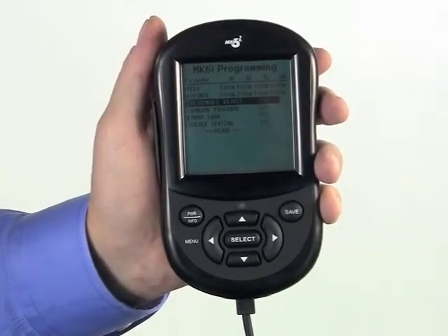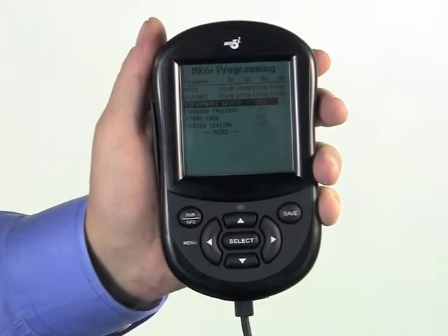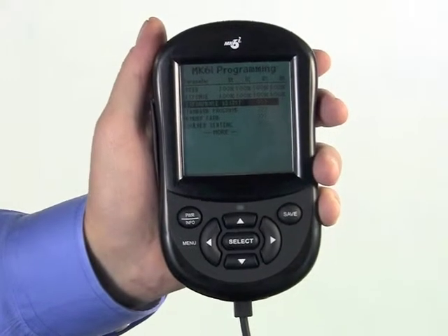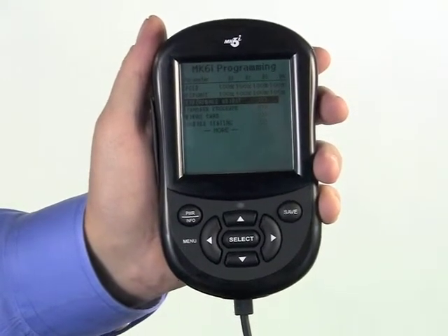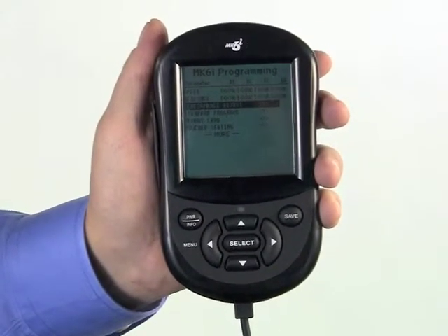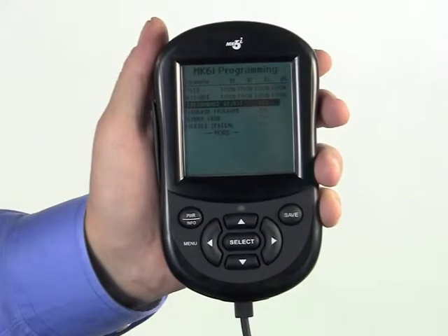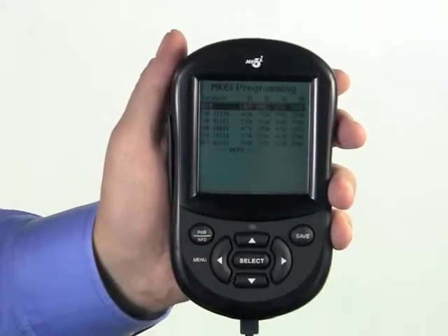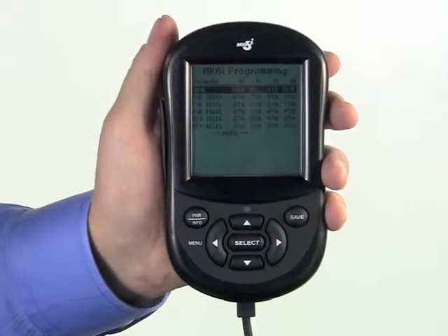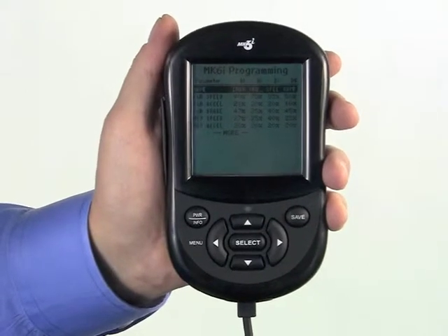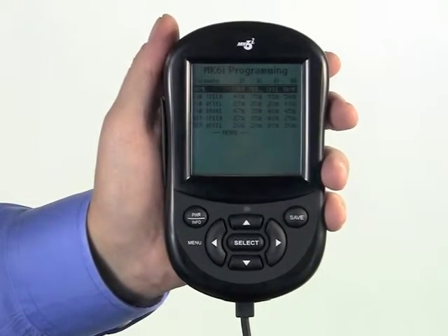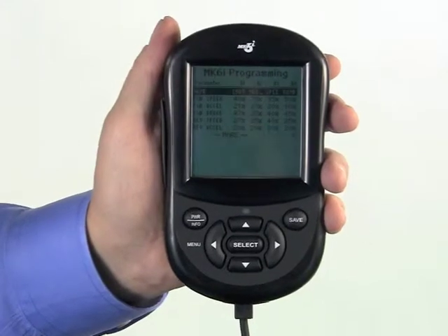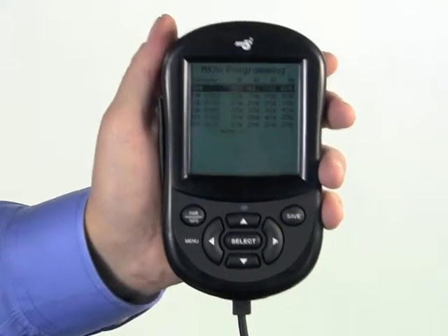Invacare power chairs using expandable electronics, or any driver control other than an SPJ, have four independent drive profiles or drive modes. What is unique about these profiles is that they are completely independent of each other. What is unique about using the Mark VI programmer is that if an adjustment or mode in any item is set differently in one drive only, the programmer will show all four drives for easy comparison.